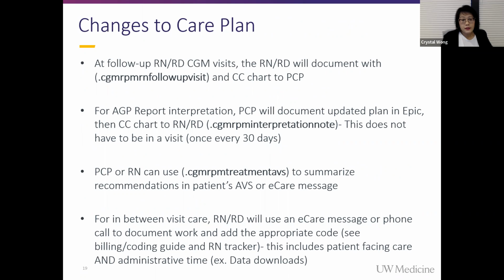Here's also just a summary. We also have another slide here that has all of the dot phrases broken down, but this is just to talk through them. So there's a RN follow-up visit note. This is for your RN and RD to use in that in-between care, like maybe they outreach the patient and wanted to check in on medication adherence or lifestyle change, they can use that. They'll also use that for just the administrative time they use to help get the reports from LibreView.